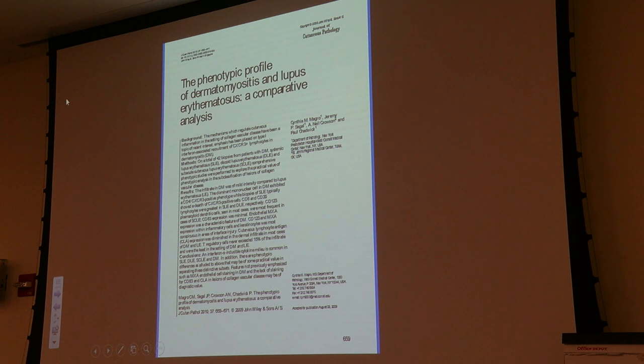And over the years, I did see cases in consultation. I continued my interest in dermatomyositis, and probably in the mid-2000s, it was established that in dermatomyositis, these patients had very strong interferon alpha signatures in their serum. So there's an antibody that we can test on tissue called myxovirus resistance protein. It's a protein that's upregulated in an interferon alpha microenvironment. So I started to study MxA in biopsies of dermatomyositis, including cases of Degos disease in the setting of dermatomyositis.